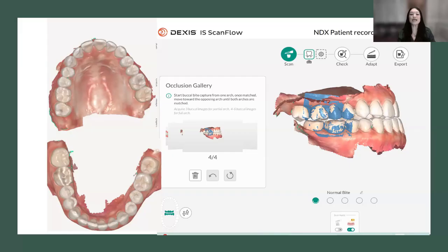So what did I say for my occlusal scan on the lower, or maxillary, mandibular, excuse me? My first scan is going to be straight occlusal. And my second scan is going to be lingual. Why? Because lingually, that's when the tongue starts to rise. You start to pull saliva as they get tired. So I like to get that out of the way. So occlusal, then lingual, then buccal for the mandibular arch.